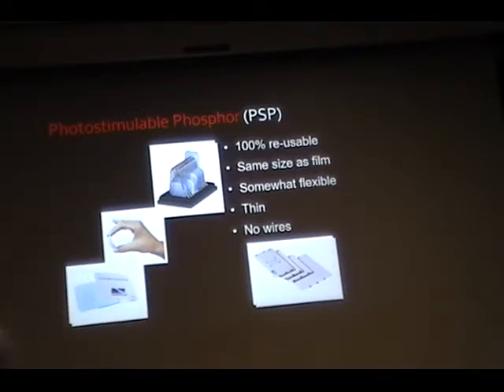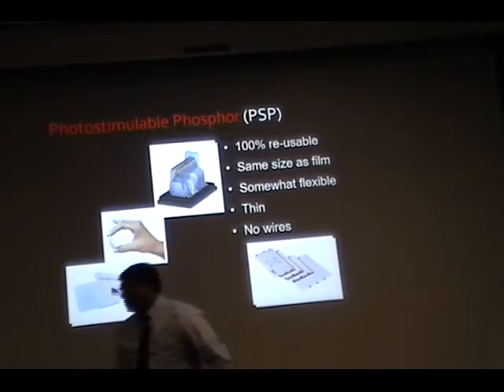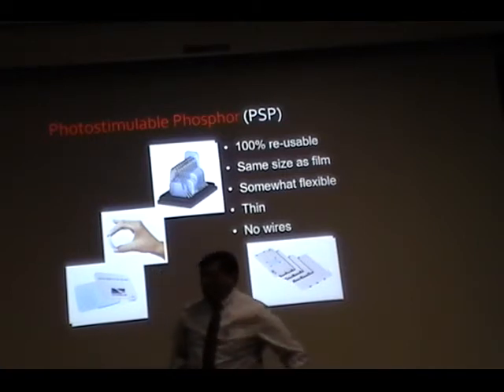Yes. I thought any flexibility would be bad because then any flexibility would create a distortion in the image. Yes, in general, you are absolutely right. There are certain circumstances, like if the patient has a torus. So we'll still get distortion, but it's the only way we can get an image. Would it be preferable in the case of a torus to have something flexible that's slightly distorted, or to just have the receptor be farther away from the source?